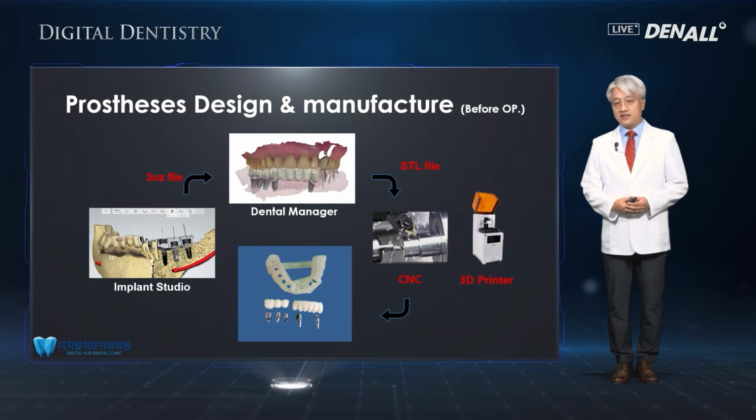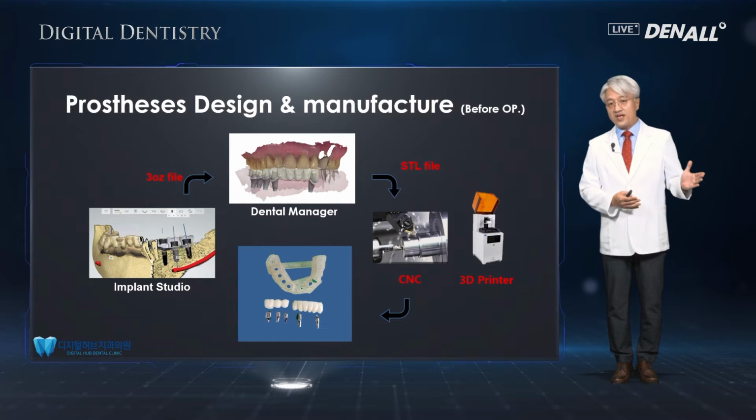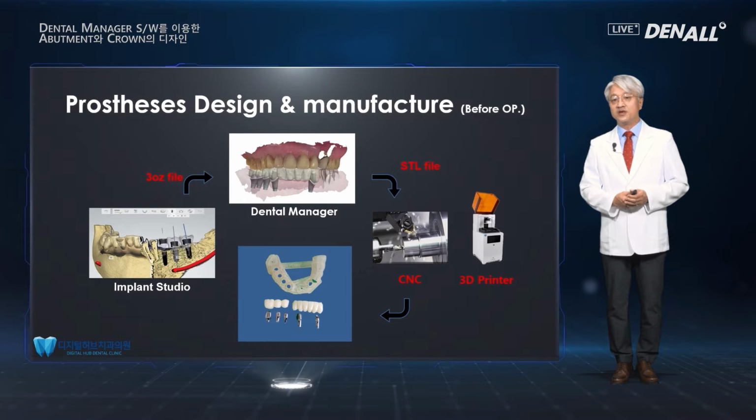Nowadays, this type of software is available from other companies, but 3Shape has a long history in this field, and we have accumulated the experience, and we have the system to maximize the precise surgery. So I always use the solution from 3Shape.